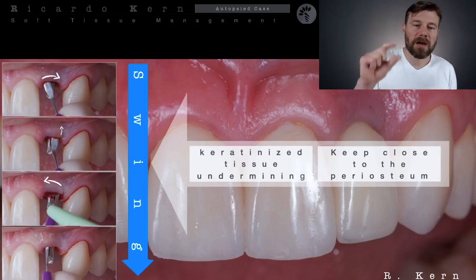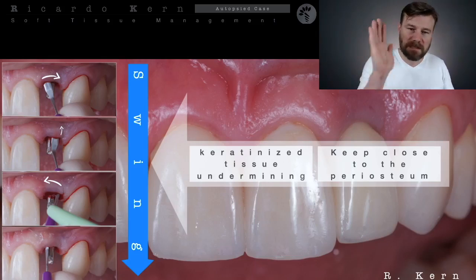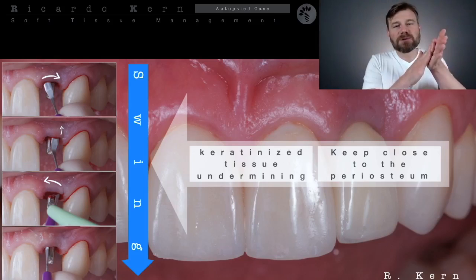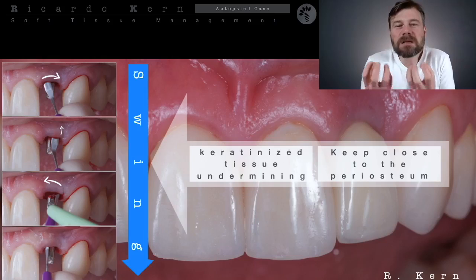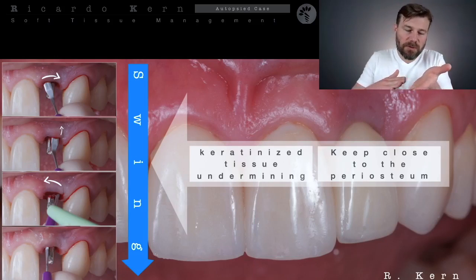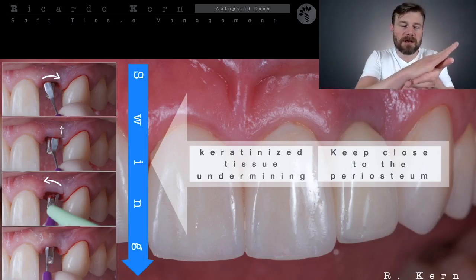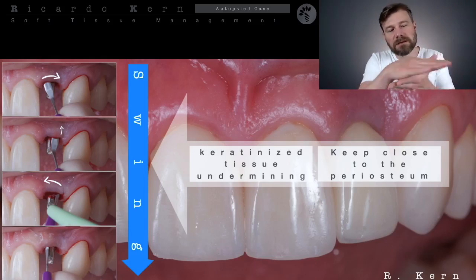So we're going to prepare in the keratinized tissue pretty close to the bone surface, the abutment or the threads of my implant, and we're going to do a swing movement with our blade. Why is that? Why is the reason to do this? Because when I start to do splitting, or when I start to do tunneling properly, what I start to do is advance inside the sulcus with my blade 4 or 5 millimeters, work in one area, and retreat and reach another area, and I prepare that, and I retreat and go in the middle.